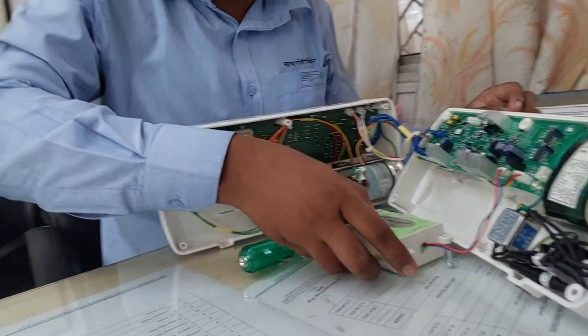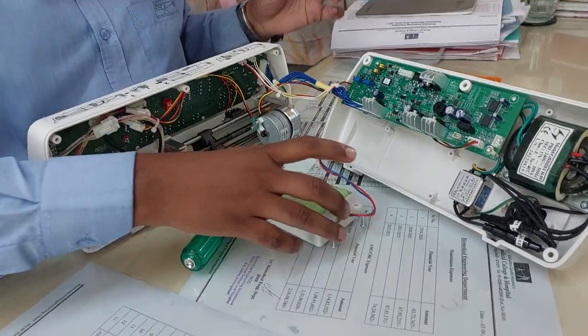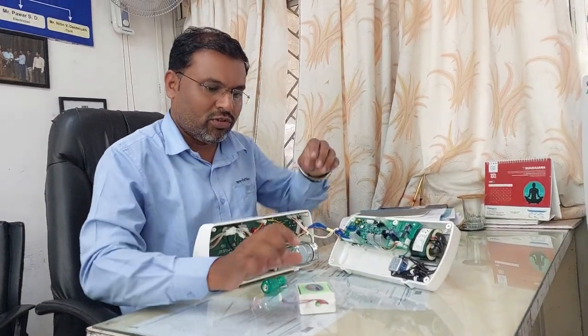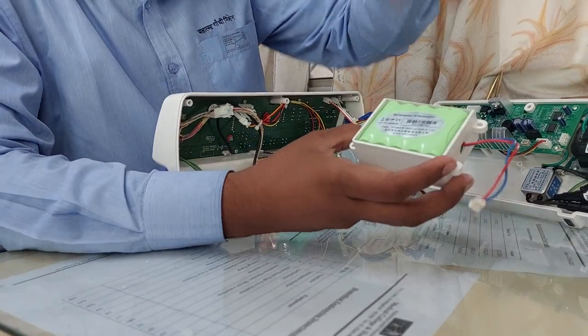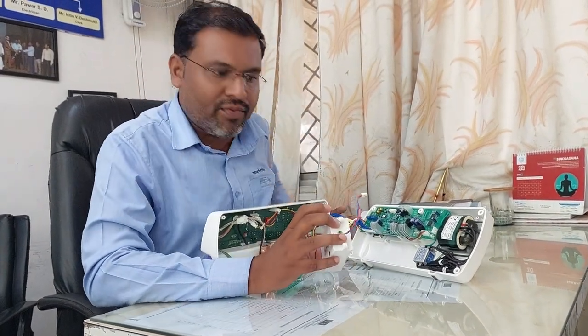In this they have provided the battery connections. You can remove it from there and you can easily remove all the battery. They have provided connections — just pull it out. Put in the new battery and again refix it.